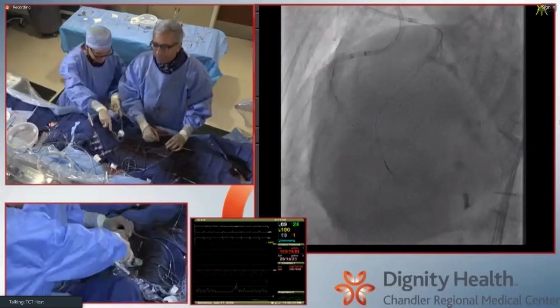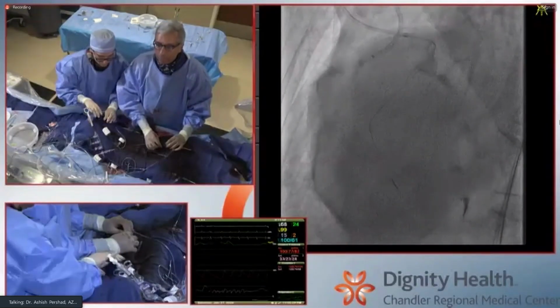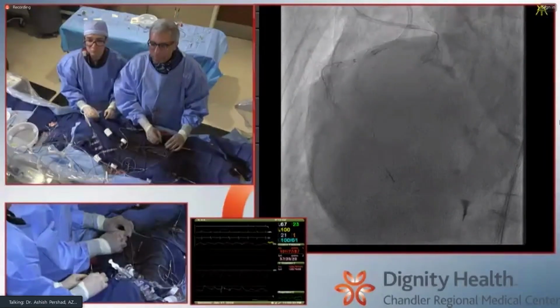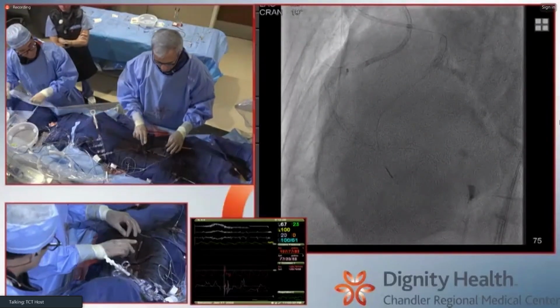D-shaped and expanded stent. We're gonna question image here again. Ashish, Dr. Kaiser Nasrullah Khan was asking about the use of cutting balloons distally to deal with those subintimal hematomas, the use of cutting balloons in the PDA to release the hematoma.